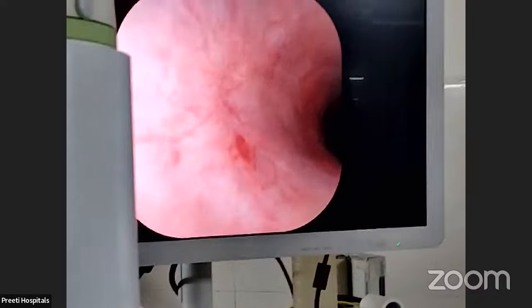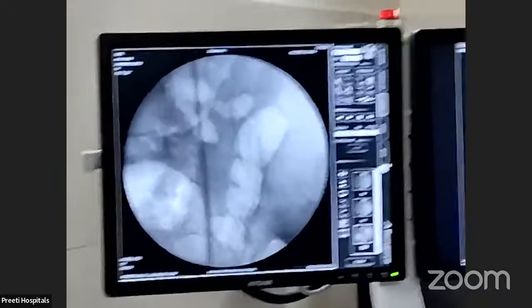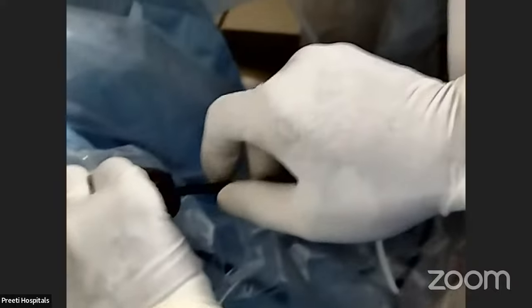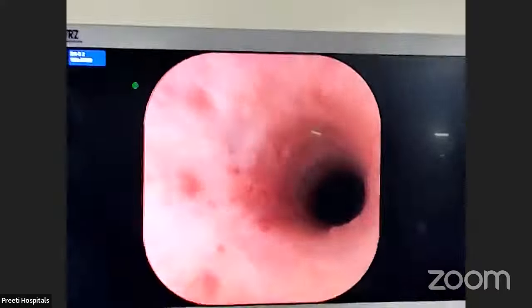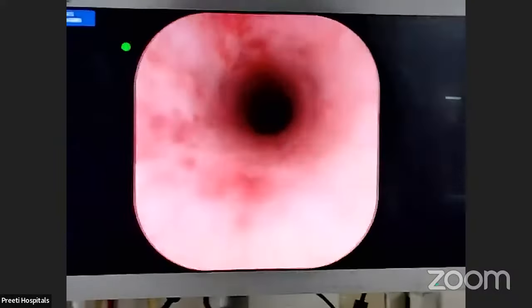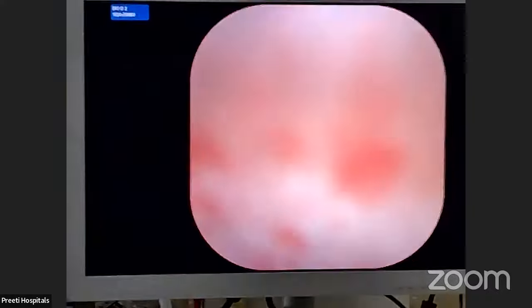So now I come below CM, come below. Yeah, I am trying, threading over the scope. Keep it there inside. Okay, this is the intricacies of this procedure. Water flush for somebody. It is not going. So no dilatation techniques, will stay, keep straight. Let the scope go inside, keep straight. Keep straight, I am telling you, see there. So for the scope only, we have to go.